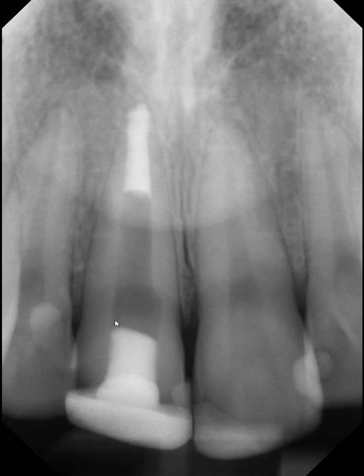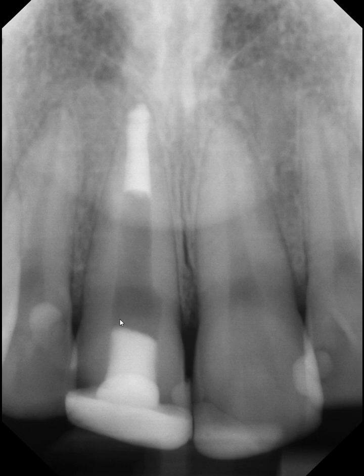This most likely represents the size of the pulp chamber at the time of the initial root canal therapy at the age of 6. And that is why this canal is large — the dentin stopped laying down additional layers due to the root canal therapy.